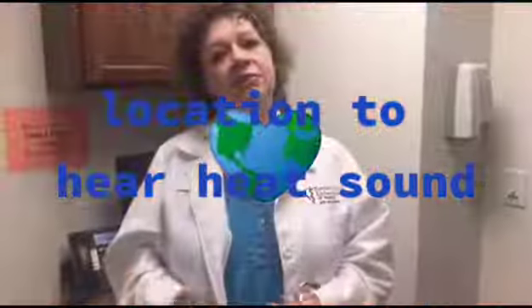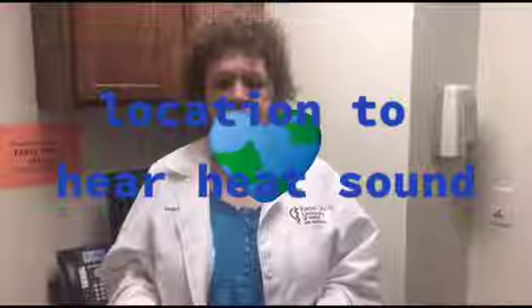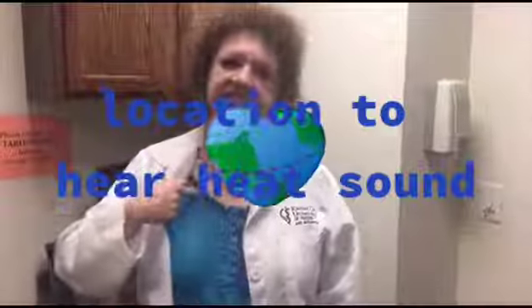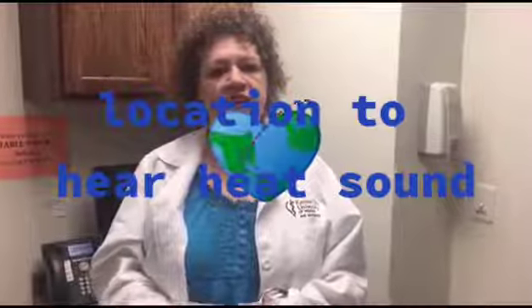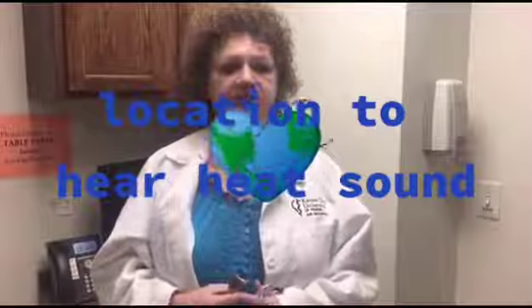So when I am instructing the patient about what I'm planning to do, I don't want to use any medical terms. So I'm simply going to tell them that I'm going to be listening to their heart in 4 spaces. And then I show that on my own body. I say I'm going to be listening here, here, a little lower than that, and then on the left chest wall. So just a second, and I'll show you how to do that on a male volunteer.